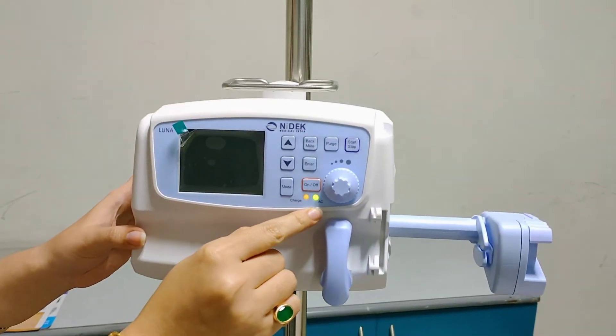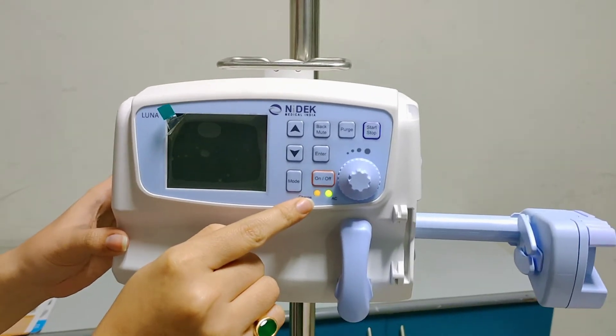There are two indicators here. We have the AC indicator, which is a green light, and this is the orange light.